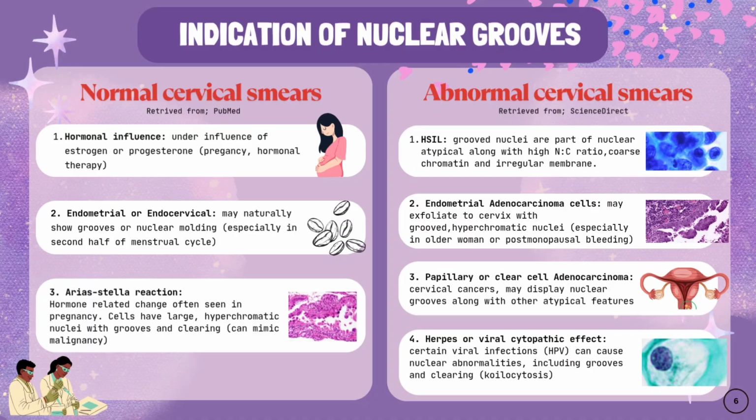Now, moving on to abnormal cervical smears. One of the key features of high-grade squamous intraepithelial lesions is the presence of grooved nuclei. These are part of the overall nuclear atypia, which includes a high nucleus-to-cytoplasm ratio, coarse chromatin, and irregular nuclear membrane.